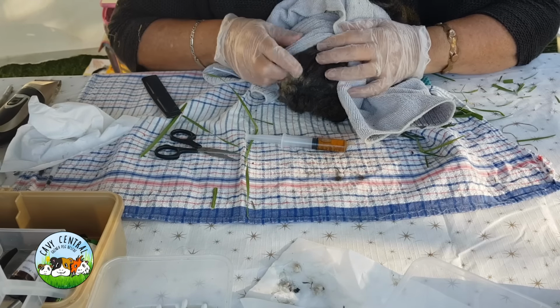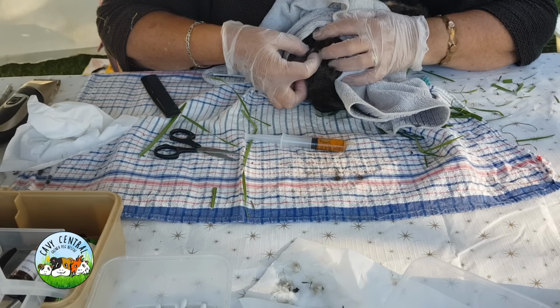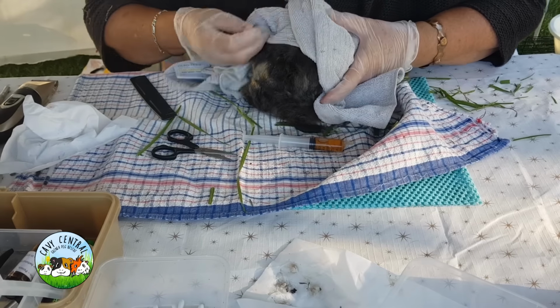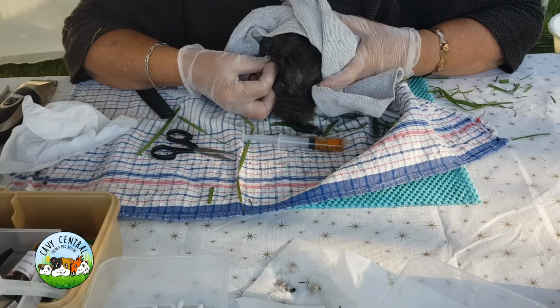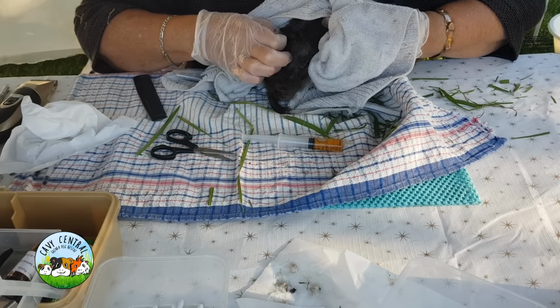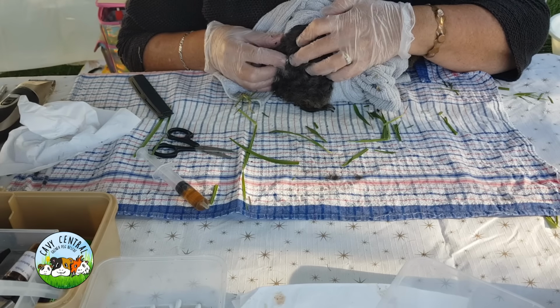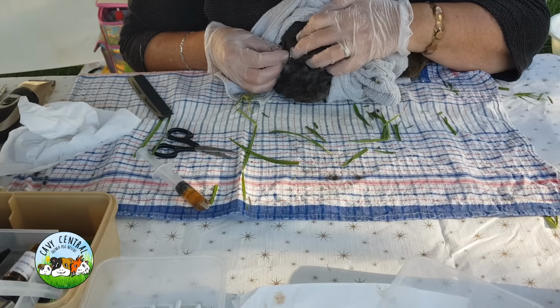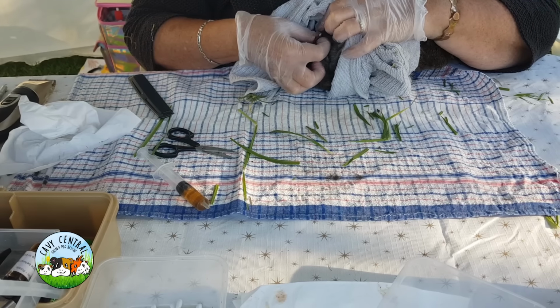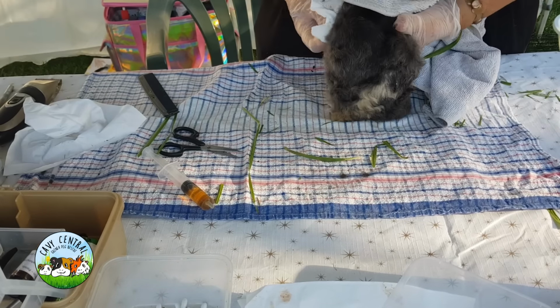I'm so sorry, Maisie, but you can see there's still a bit of white there. The minute you flush, you always find there's a little bit more pus material that needs to come up from the deepest depths of that little infected pocket. I know. Oh, come on. Let's get that out. Okay, so there was a little bit more pus you see coming up and out. Again, we just clear that out. You have to get all of it from out of that pocket. Okay, all done. I've got to do one more flush though.